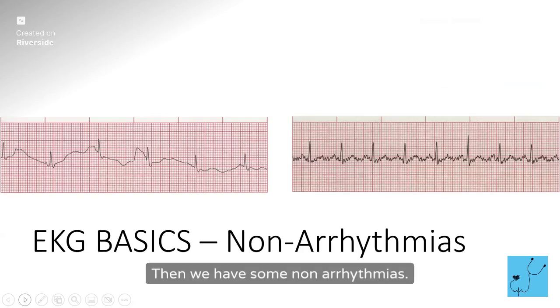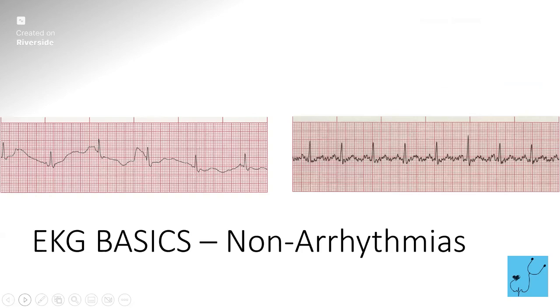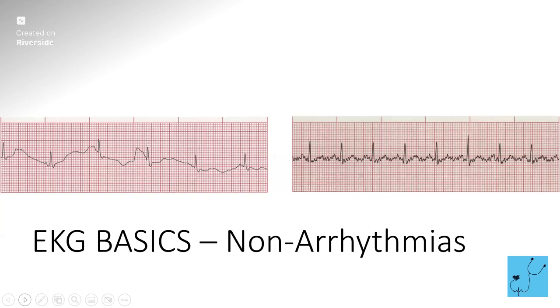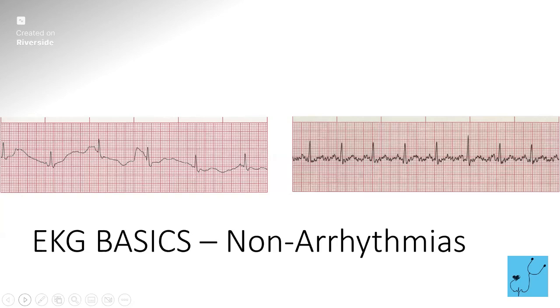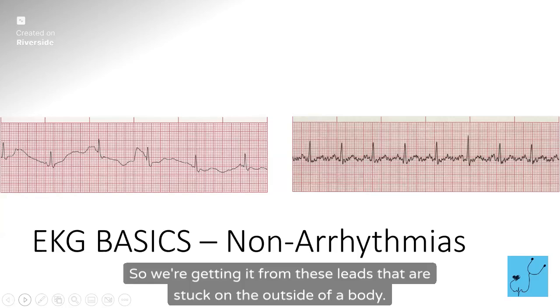Then we have some non-arrhythmias. So what do you think is happening in this one? And can you guess what the rhythm is, even though it looks funny? Where are we getting these readings from? Where do these waveforms come from? Like, how do we get them? The nurse puts patches on, right? So we're getting it from these leads that are stuck on the outside of a body.